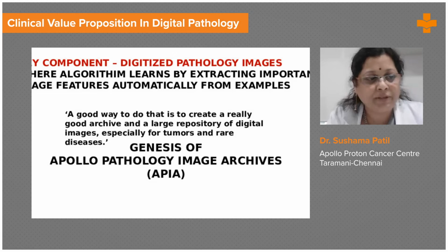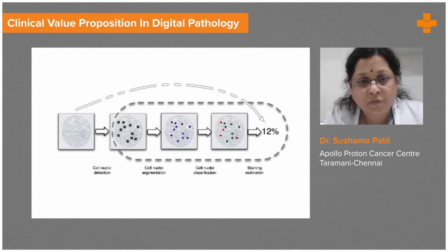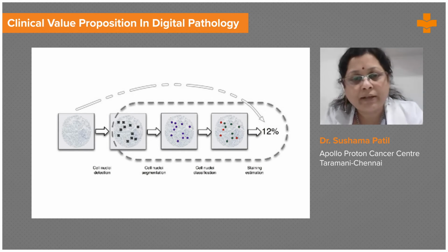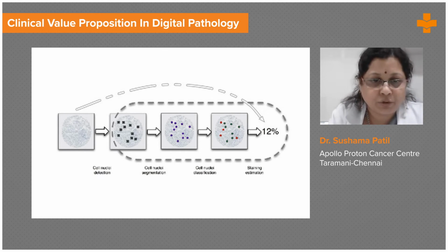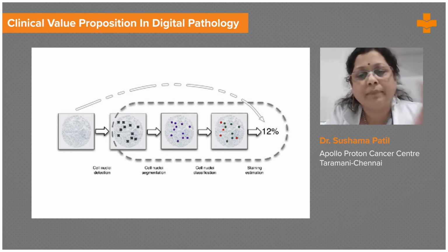So if the images are large in number, the algorithms can become robust when the data is collected from a large array of slide imagery. So how does it work? First we have an input image where a slide is chosen, and we segment the slide for key features, which are fed into the system, and algorithms are written. So the output slide will tell us what is a normal and what is an abnormal slide.